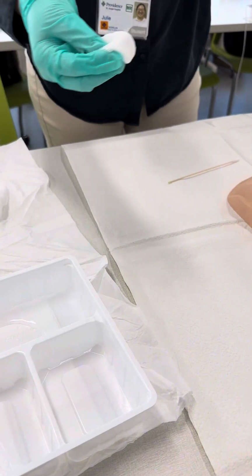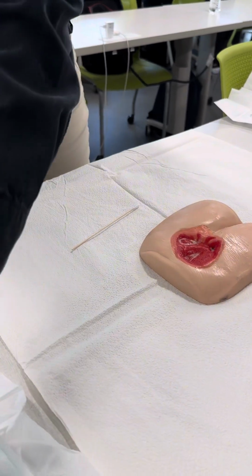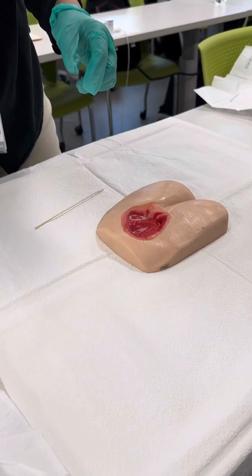So for this part, putting it in, you can use your sterile forceps, and that will basically be your Q-tip. Then your wet to dry dressing. Oh, there's one already. I didn't realize.